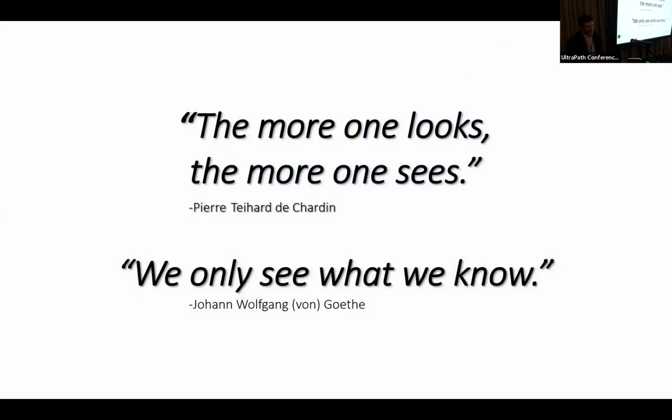So just to get started, a couple of quotes, kind of get our heads in the right spaces. The more one looks, the more one sees. I think that's all true, and it's also true for us here in the electron microscopy business. And then it's also true that we only see what we know.